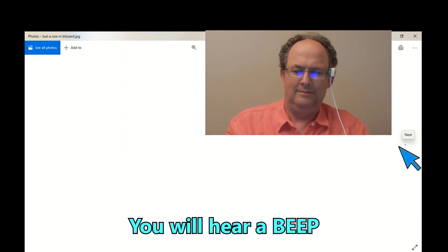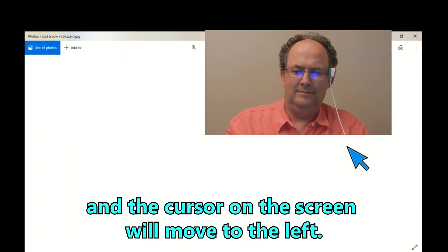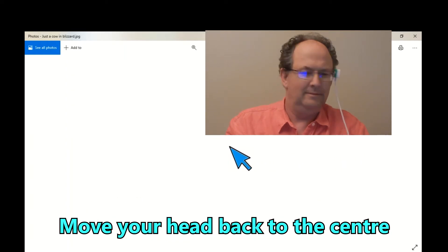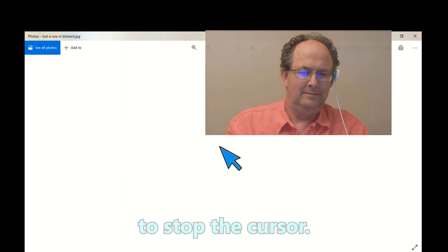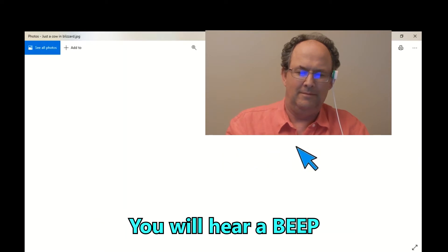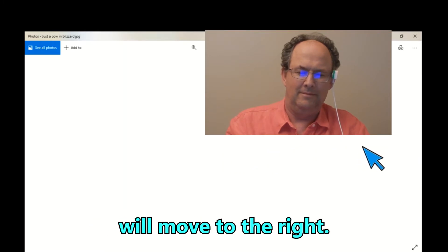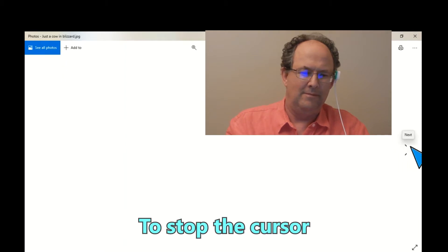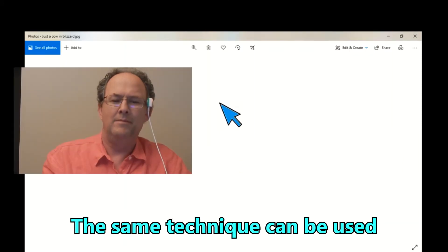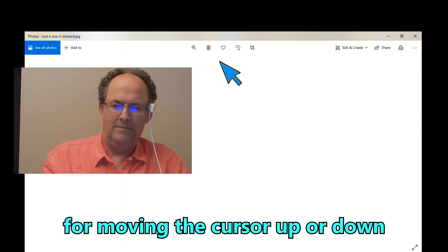You will hear a beep and the cursor on the screen will move to the left. Move your head back to the center to stop the cursor. To move the cursor to the right, turn your head to the right. You will hear a beep and the cursor on the screen will move to the right. To stop the cursor, move your head back to the center. The same technique can be used for moving the cursor up or down.